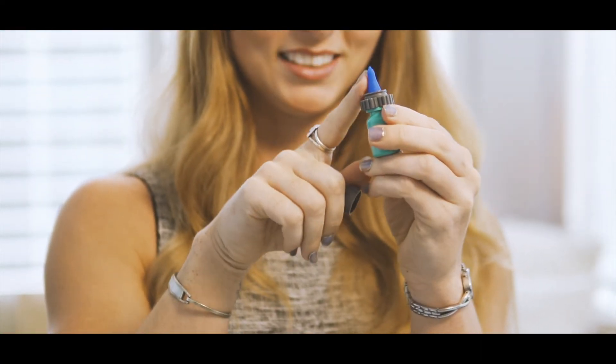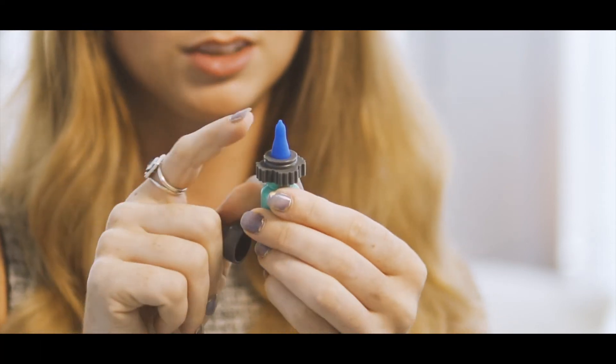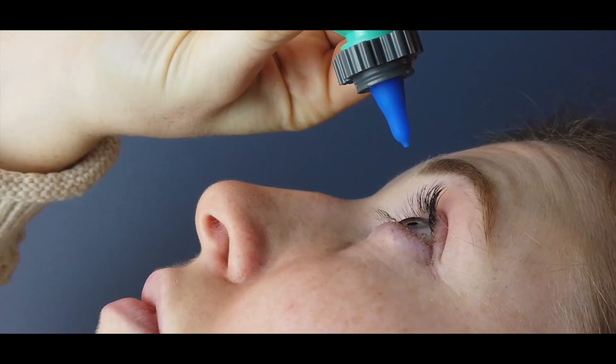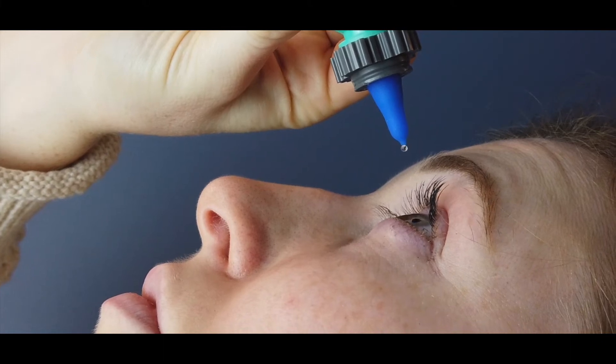This is really the magic piece — this little blue tip. It's a soft medical grade silicone so it doesn't poke your eye. It just makes the drop smaller, so you would really just take your drops normally and then replace the cap.